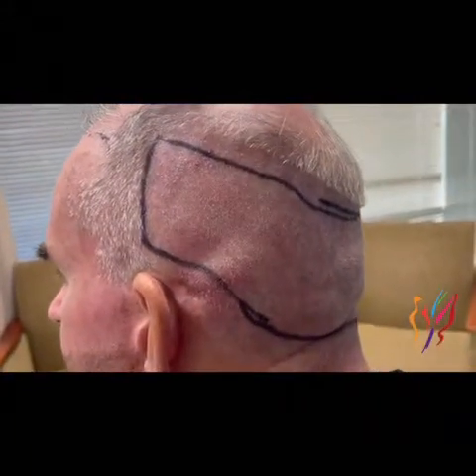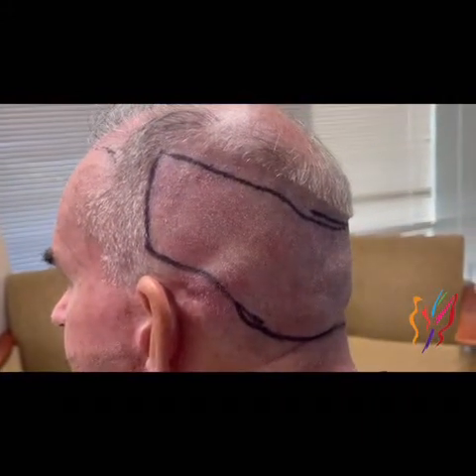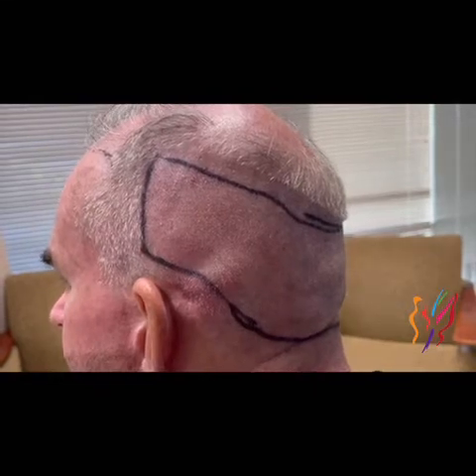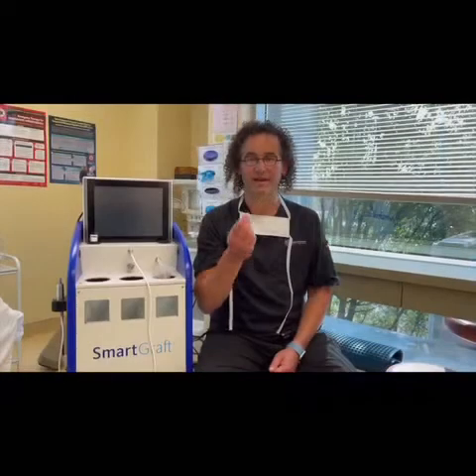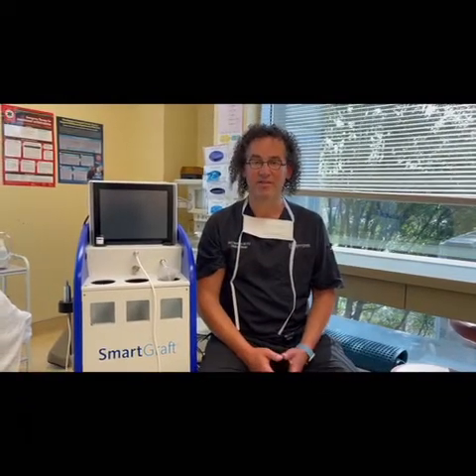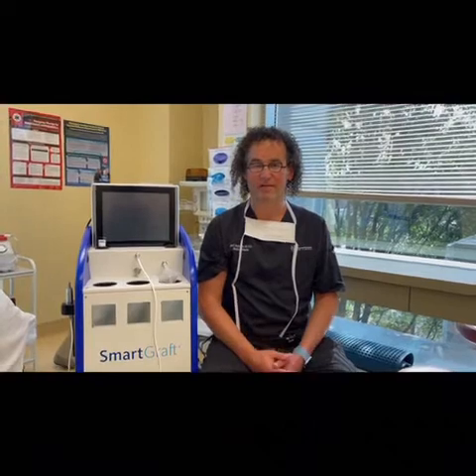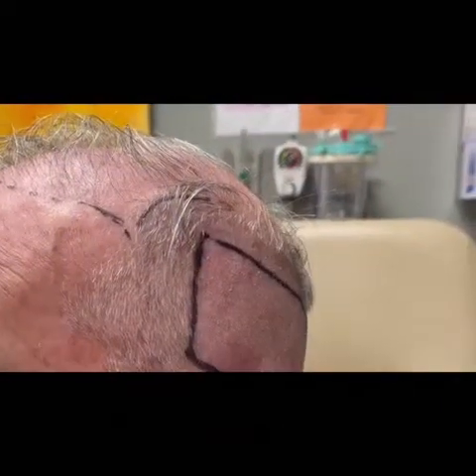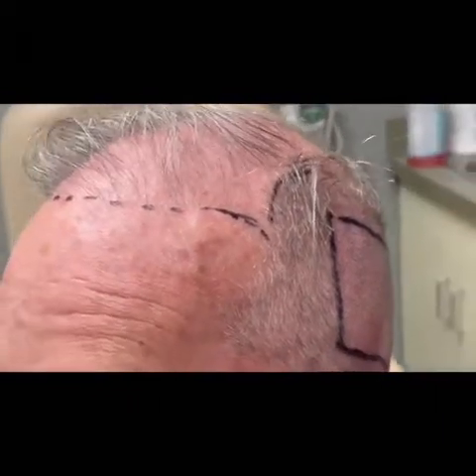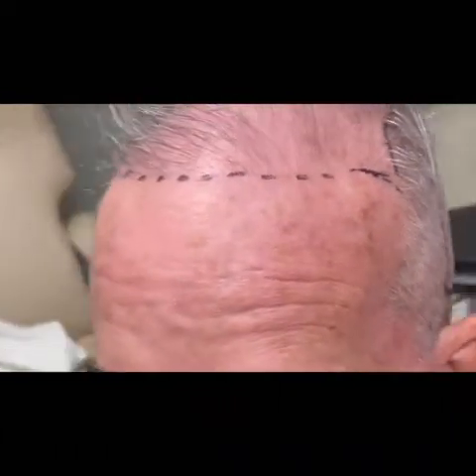So the way the SmartGraft works is after the donor area, that is the area where we're going to borrow hair from, is shaved, we'll give you a cocktail. That cocktail mostly consists of Valium. Valium is a medication that will help you relax throughout the entire process. We'll take you back to the operating room. We'll make sure that we've confirmed the appropriate hairline design, and we will begin the procedure.